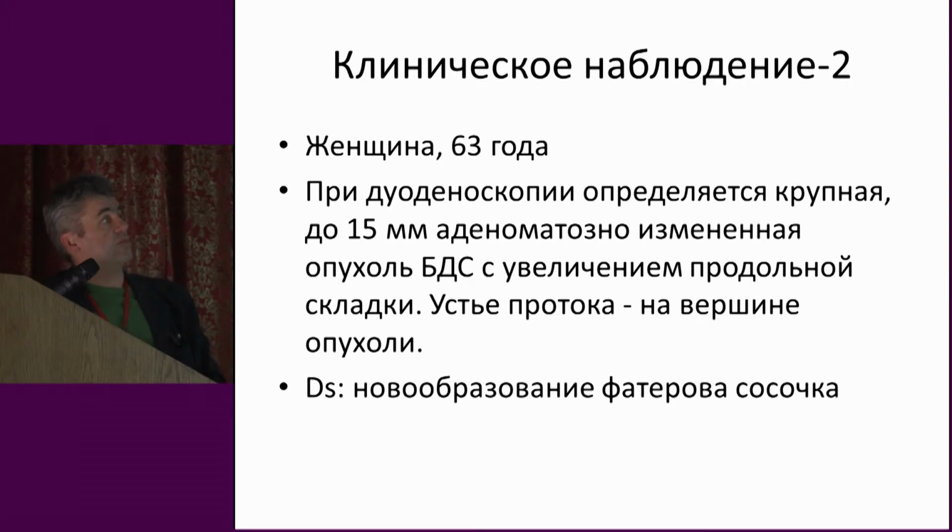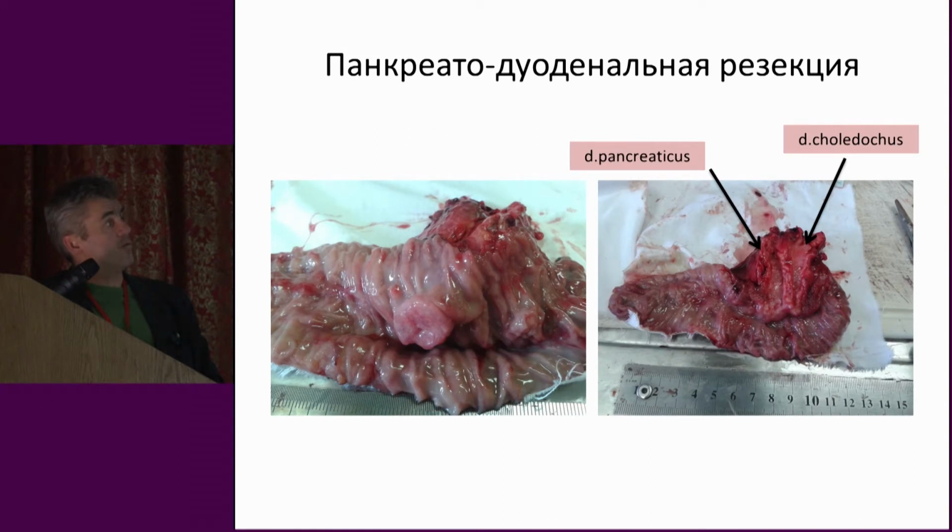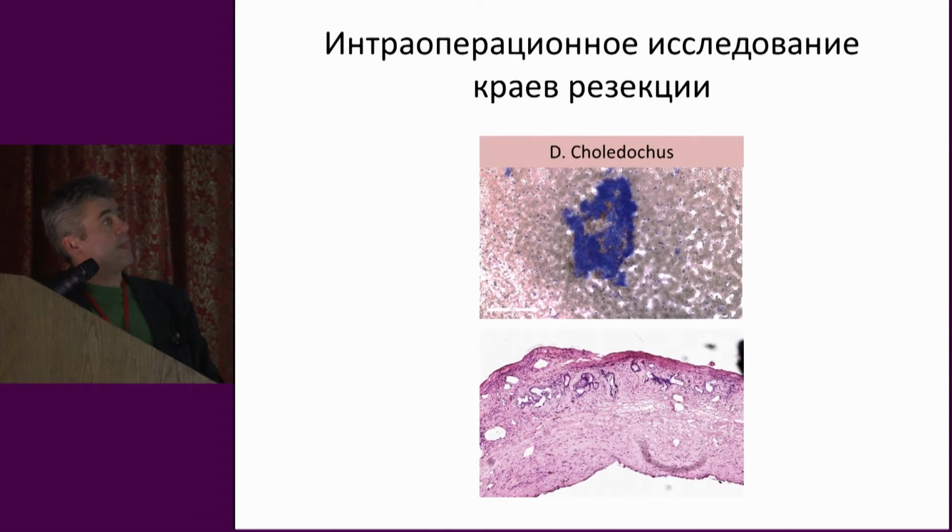Now a second clinical case. It's a woman, 63 years of age. The endoscopy showed a large tumor of the large papilla, up to 15 millimeters, and we verified it as highly differentiated adenocarcinoma, papilla adenocarcinoma. It looked like that, and we studied the CBD and pancreatic duct.